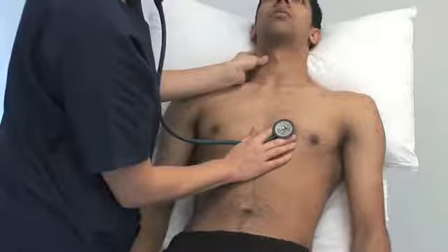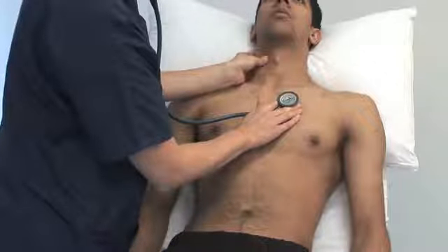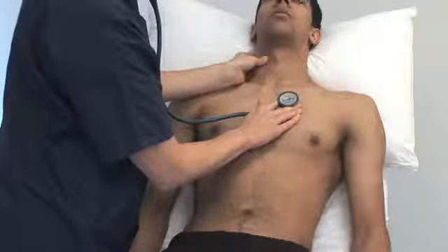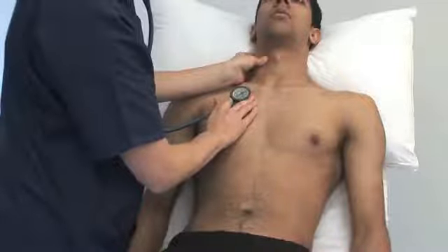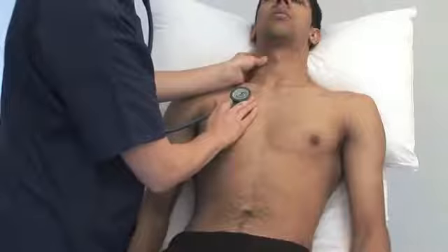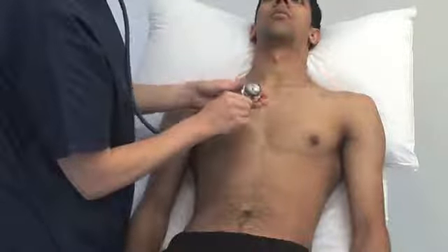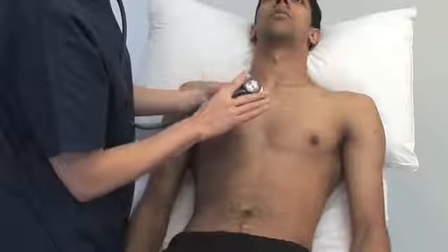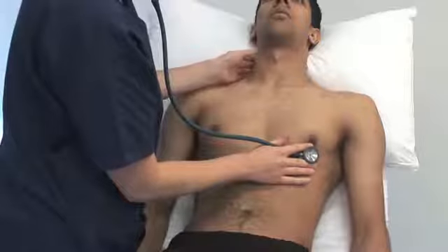Feel the carotid pulse with your thumb to time any murmur. Concentrate in turn on systole and diastole. Listen for added sounds and then for murmurs. Soft diastolic murmurs are sometimes no more than a so-called absence of silence. Listen to the precordium systematically with the bell and then the diaphragm.